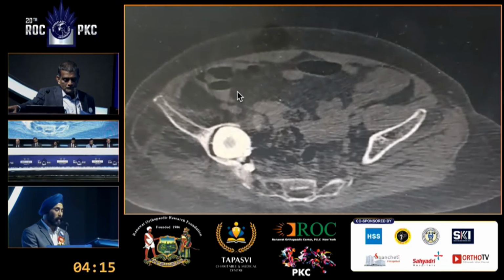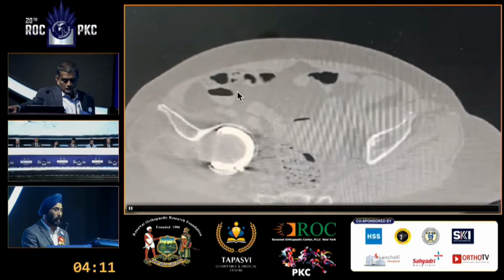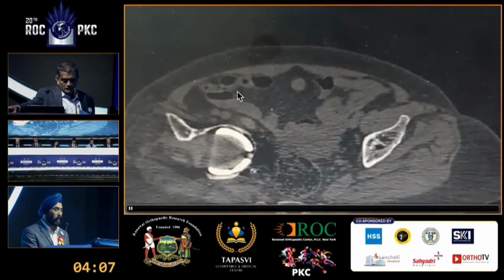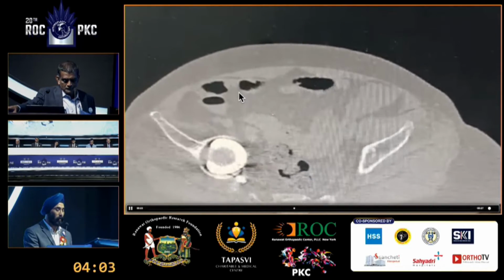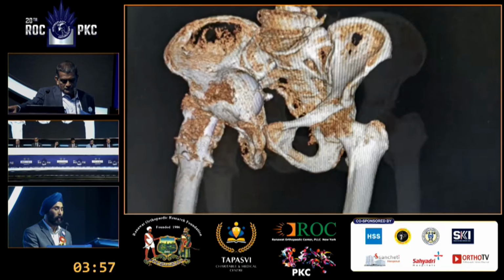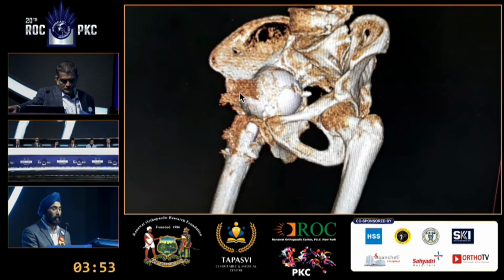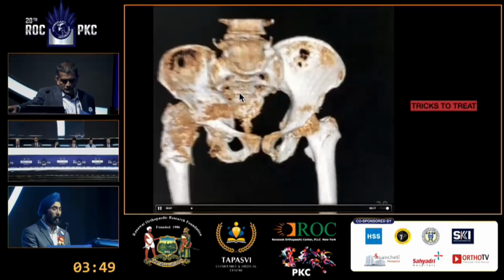So we're working on the CT scan. So these are CT scan sections. So there are areas where protrusio has grossly gone in. We do still have columns which are weak. They are slightly supportive, but not so. And that's a 3D analysis. So a couple of pictures of a 3D. We do have a bone there. But as you go more medially, that's a protrusio. That's the head coming in with the screws. And that's a 3D reconstruction.